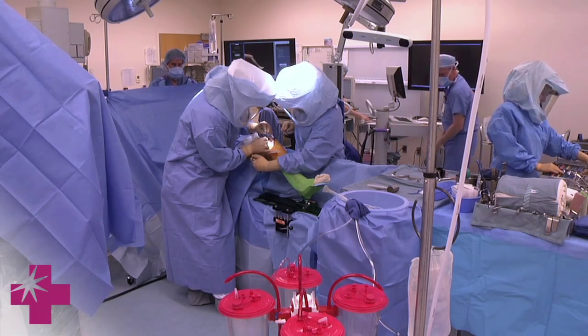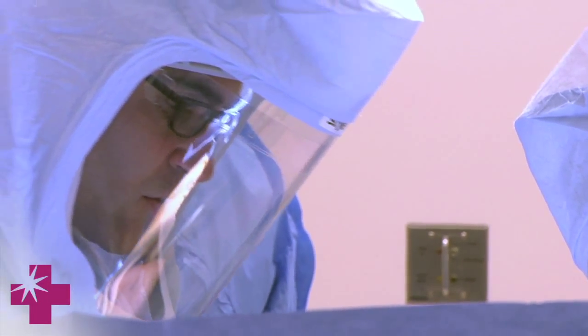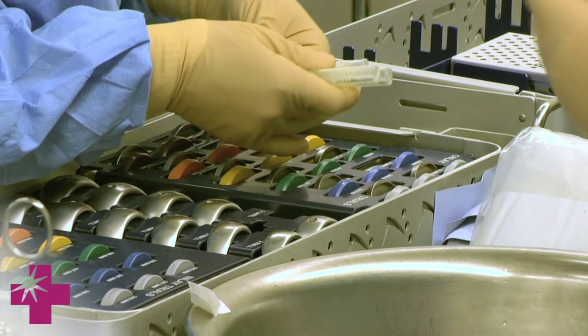This is a much less invasive procedure than total knee — it's not entirely minimally invasive like arthroscopy, we still need to make an incision, but it's a much smaller incision than you need for a total knee replacement. We have better tools now so we can do a much better job of putting that implant in an absolutely perfect position.